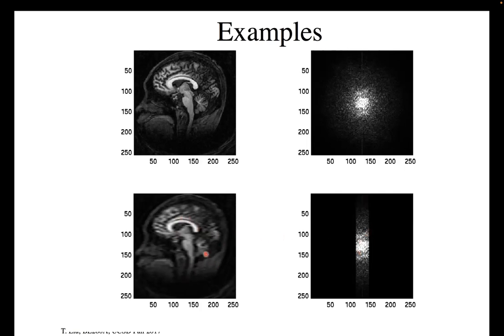It's a pretty good picture, but a lot of artifacts and blurriness because I'm missing a lot of raw data at the high frequencies of the Fourier space. But how we go into the Fourier space and sample all of this is essentially the major design criterion for determining what your pulse sequence is doing.